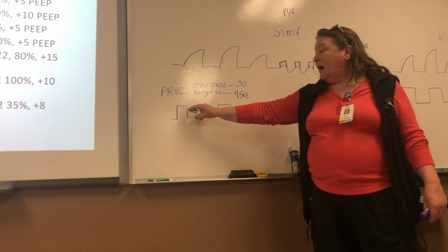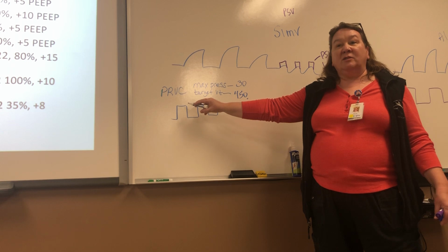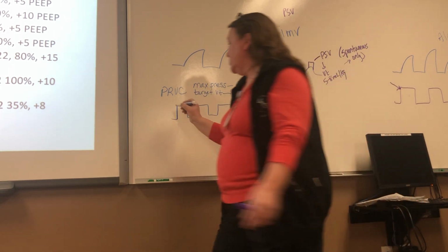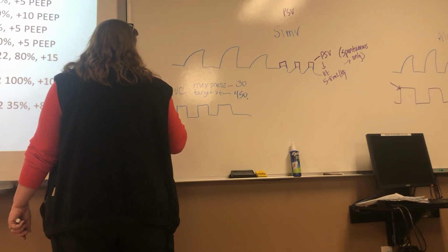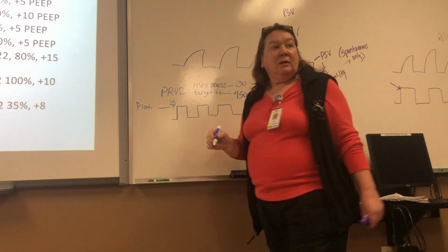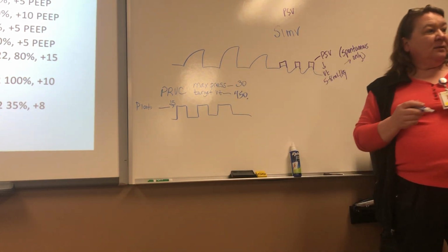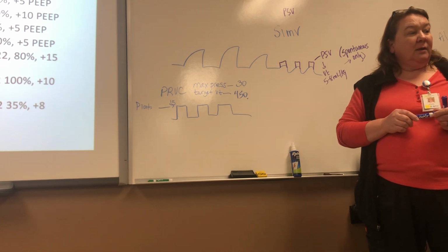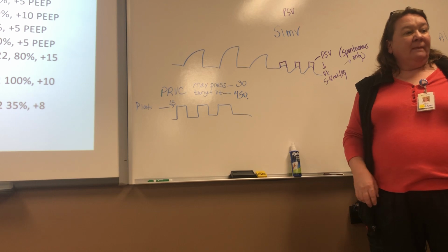So when it first starts out, it's going to do a breath hold, and it's going to determine what the patient's plateau is. I mean, this is just informational. It's going to do a plat here. And let's say your plat is 15. So then that's going to be the starting pressure it uses in PRVC. Yes? So this is what she was talking about yesterday when she said it's going to do a test breath and then adjust based on that. Yes. Okay.